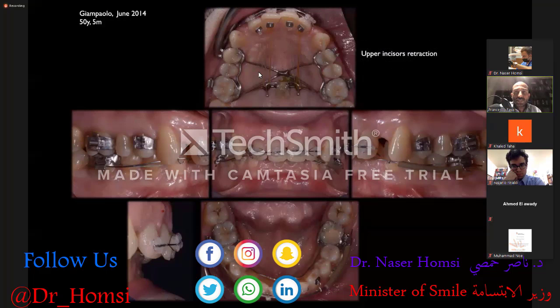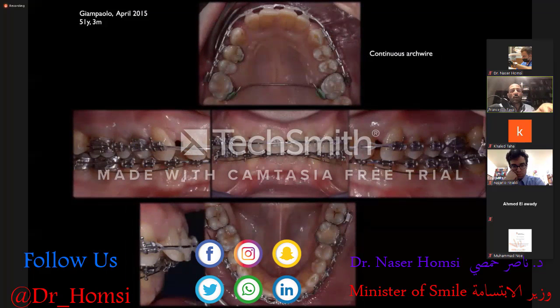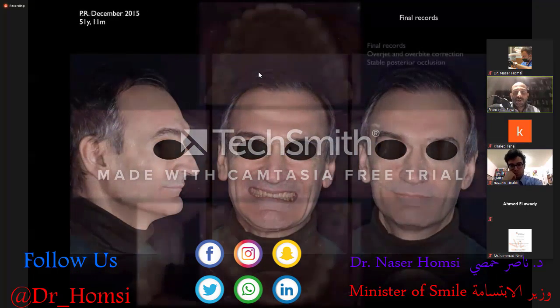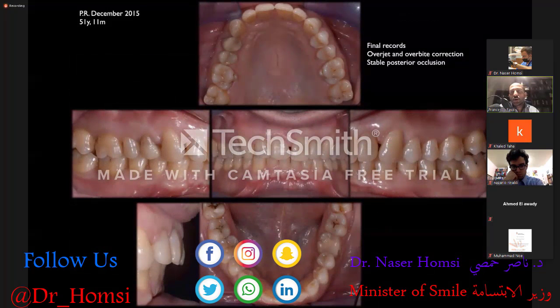Here we have a good incisor retraction, and so after the vast majority of the space closure, we can go for a continuous arch wire and go for finishing and detailing with minor aesthetic issues. Here we have final records with good overjet and overbite correction and good stable posterior occlusion maintenance.